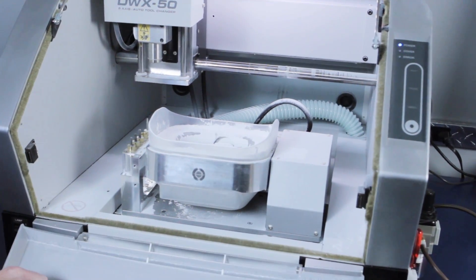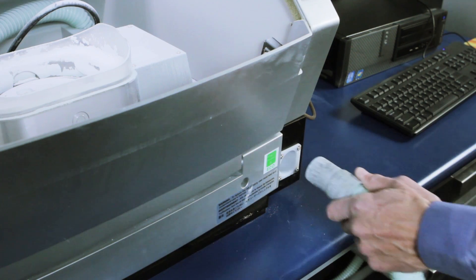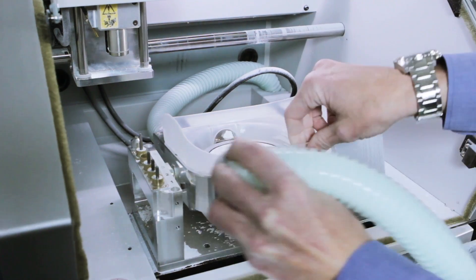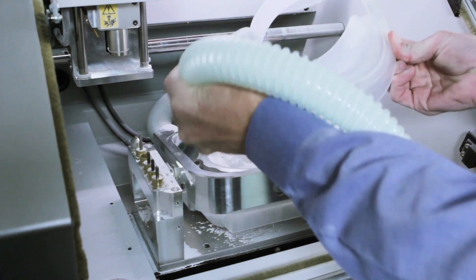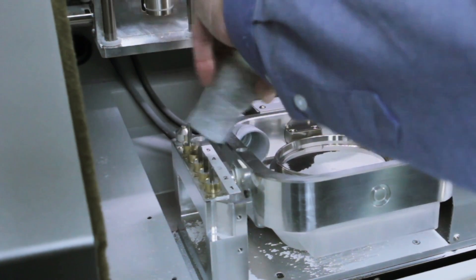Begin by opening the front cover. Next, pull the dust collection hose out of the front of the DWX50. The placement of the hose in the front of the mill was designed for easy cleaning. Use the vacuum to carefully remove cutting waste throughout the entire rotary area.